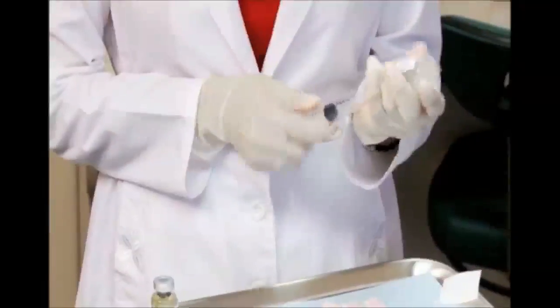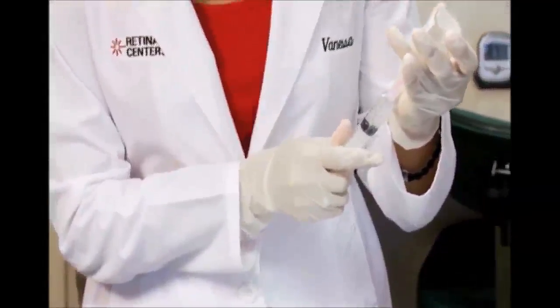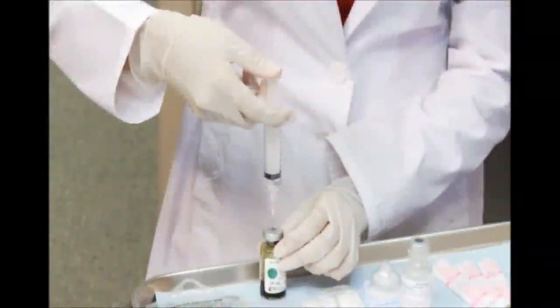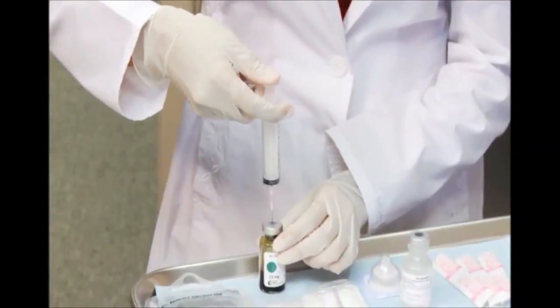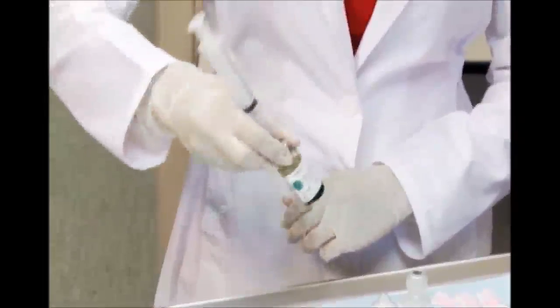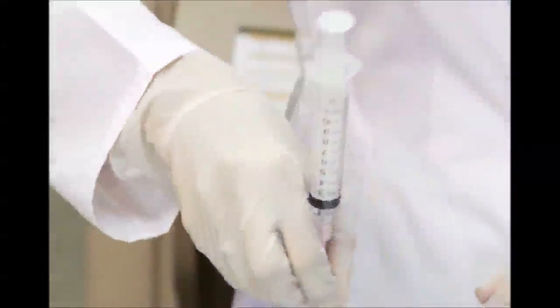To begin, use a standard syringe and needle to withdraw 7 mL of sterile water for injection. Inject the sterile water into a vial of Visudyne powder. The vial should be agitated gently until the contents are fully reconstituted to make a 2 mg per mL solution.